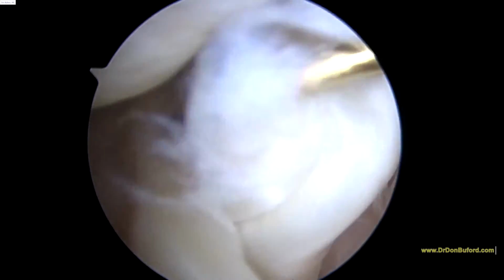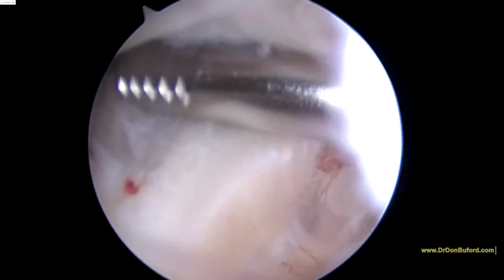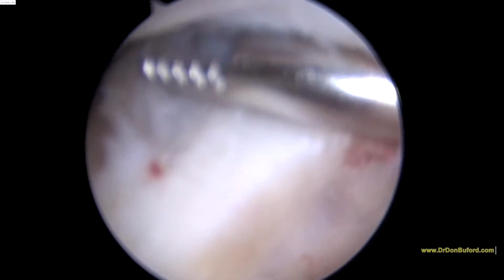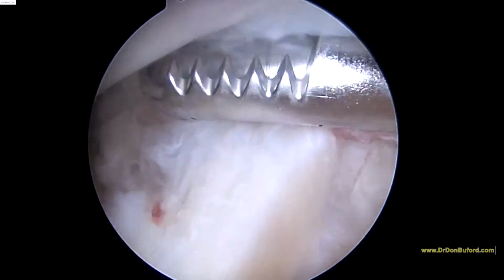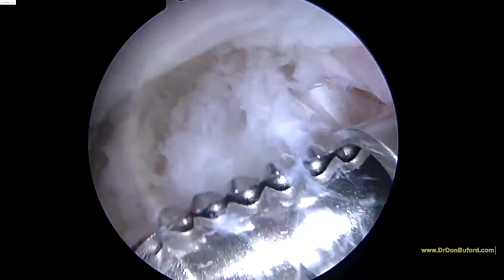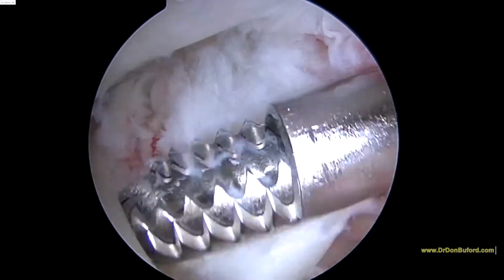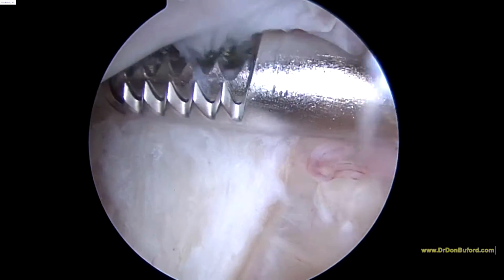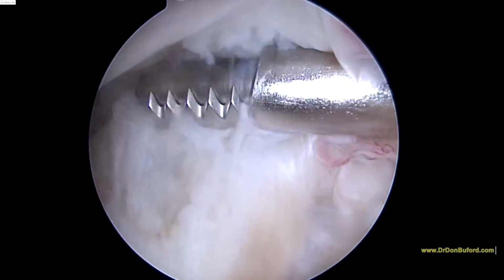Okay, pause. Okay, so now we're just, first of all, we're going to focus if we can. And we're just going to clear off some space on the insertion of this subscap tendon here where it's torn. We haven't done anything to the tendon, so that's just tearing that you had. And we're going to plan on placing an anchor into the bone basically right about here.